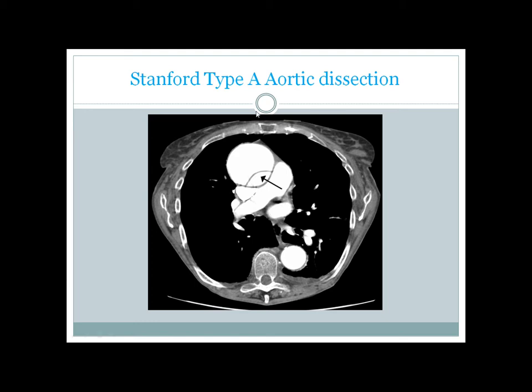If you see the structures here, this is the anterior chest wall, this is the sternum, those are the ribs, and this is the chest wall. This is probably a female patient, and those are the scapulae here. Those black zones are the lung fields, those are the pulmonary vessels, here is the vertebra, and these are the back wall muscles.